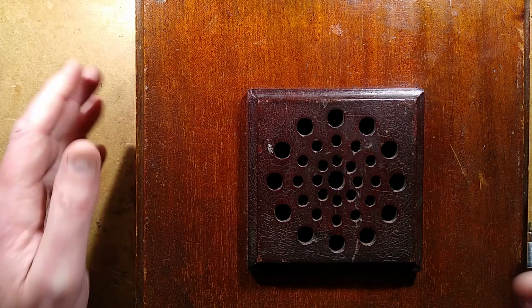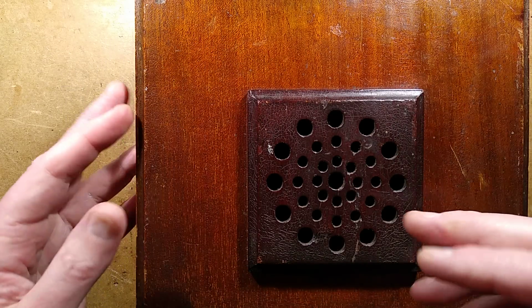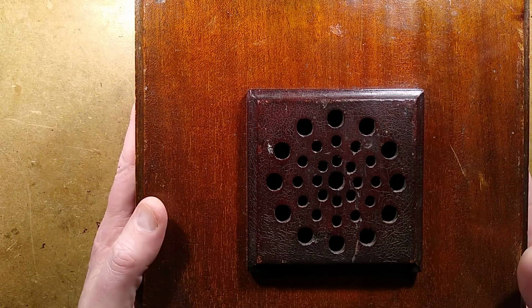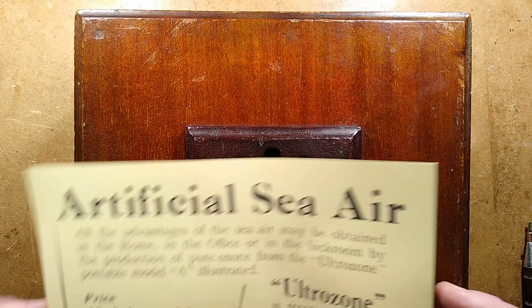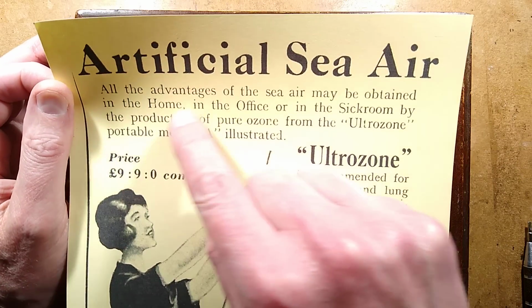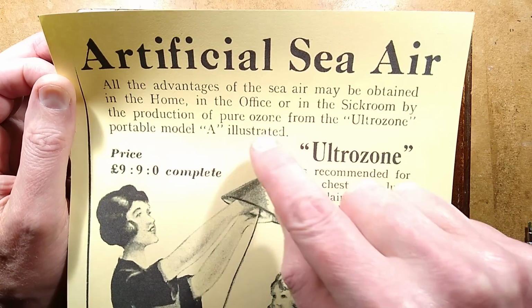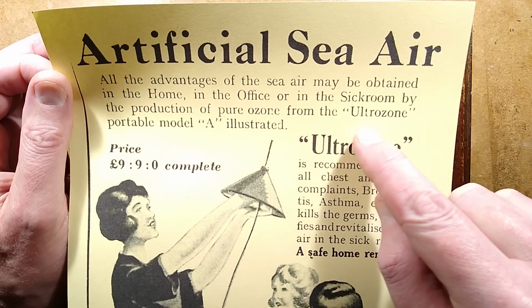Wow, this isn't scary at all. It's a 1920s piece of electro-medical apparatus that claims to generate artificial sea air, ozone in other words. All the advantages of the sea air may be obtained in the home, in the office or in the sick room by the production of pure ozone from the Ultrazone.